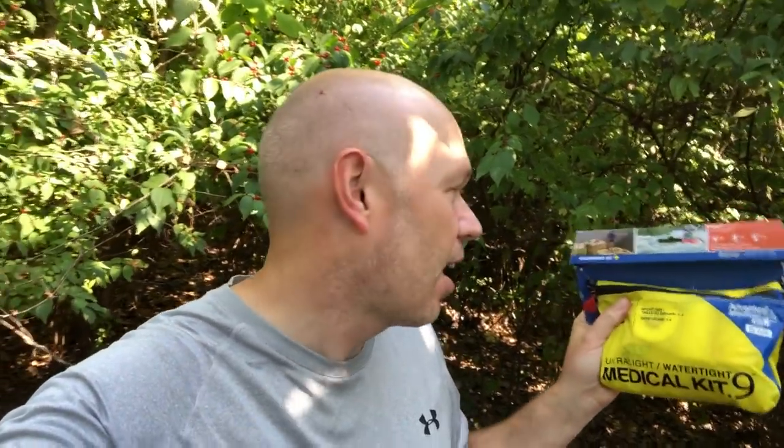Big Crazy John here with Big Crazy Outdoor Adventures. I have a medical kit we're going to review today and it's the Adventure Medical Kit - the ultra light watertight medical kit, the .9. There's a number of these Adventure Medical Kits that are different sizes, and this is kind of a medium-sized one.